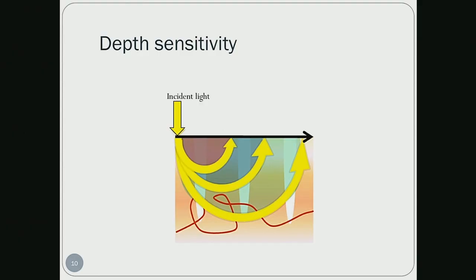So thinking about in vivo applications, one question that's important is depth sensitivity. As you move further from your illumination source and you collect light, your light on average is going to come from deeper in tissue, which is shown here. This is important for tissue because if you're interested in a particular process, most likely it's not distributed homogeneously, infinitely in depth. It's at some localized depth.